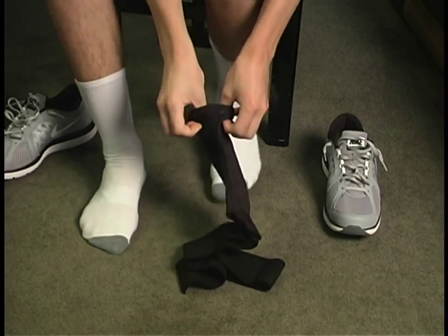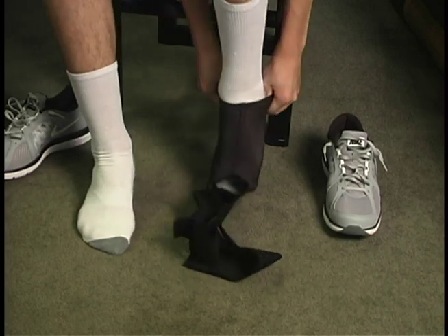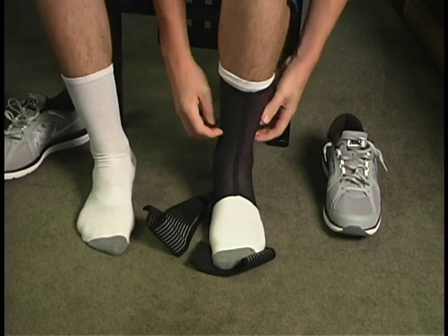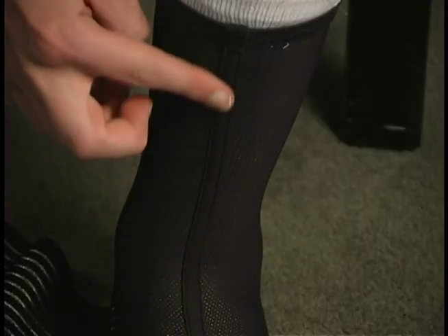Pull the support onto the foot until the heel fits into the heel hole. Adjust so that the front seam is centered.